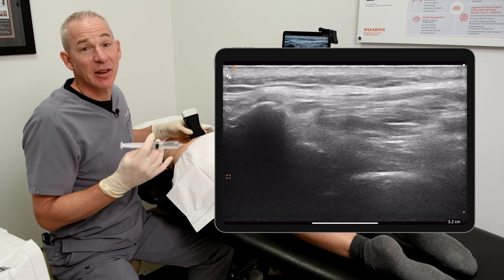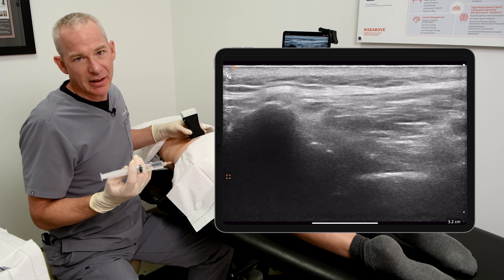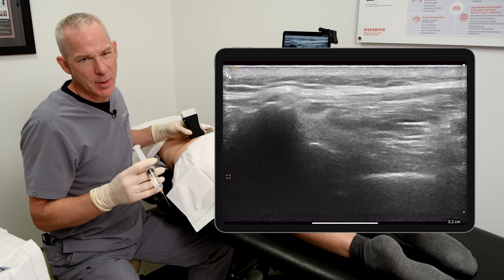Sometimes I'll inject the contralateral SI joint from this side. But for our demonstration today, I'll be injecting the near SI joint, or the ipsilateral SI joint.